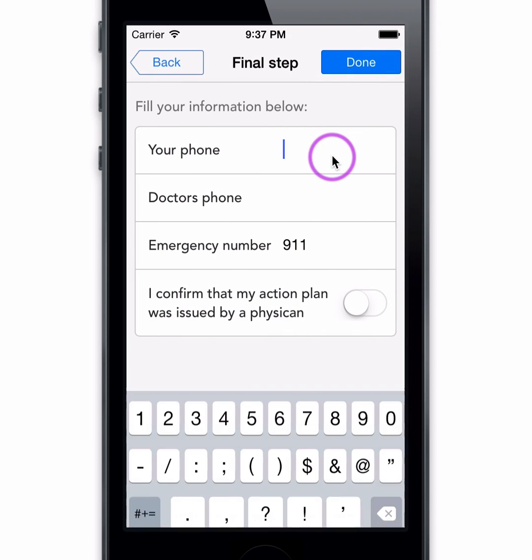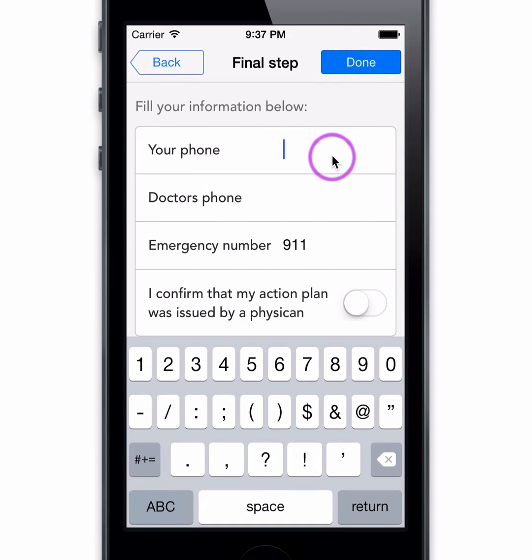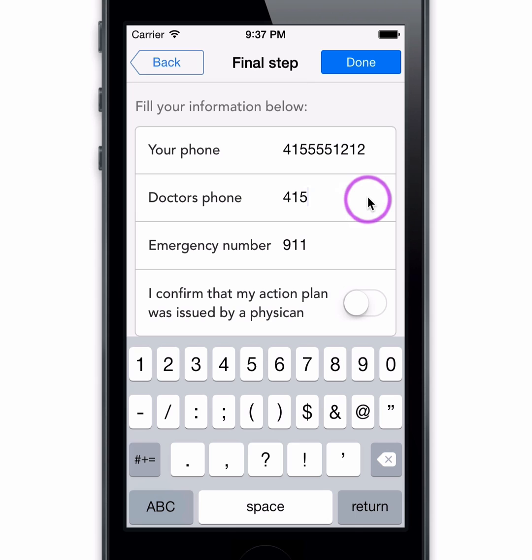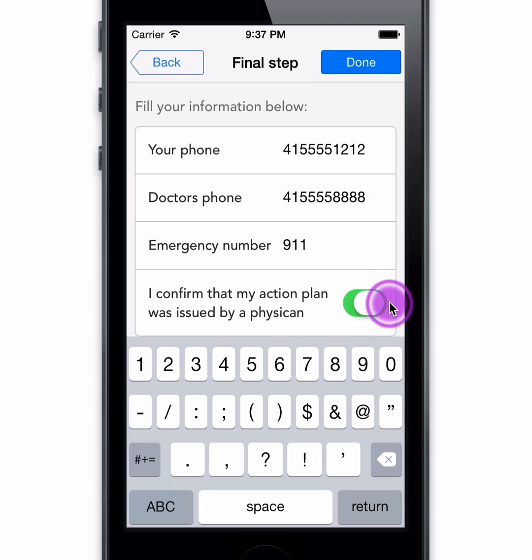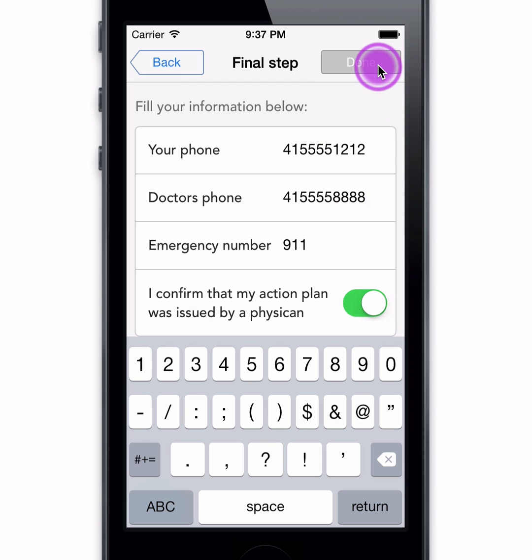Enter your personal and your physician's phone numbers, and set your emergency number. Last, confirm that a healthcare provider issued your action plan and tap Done.